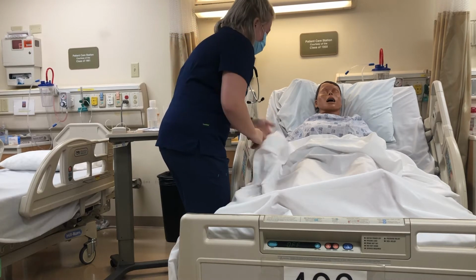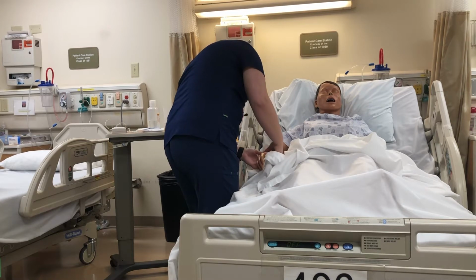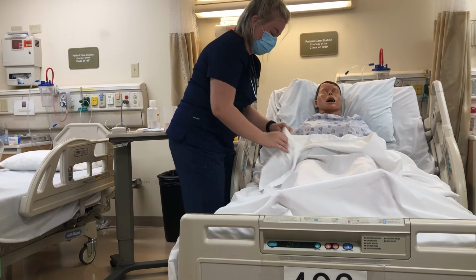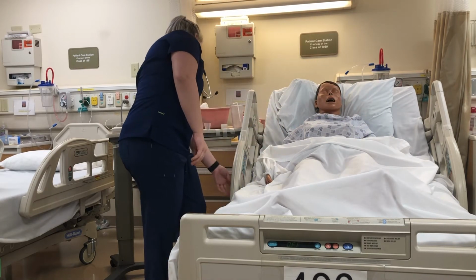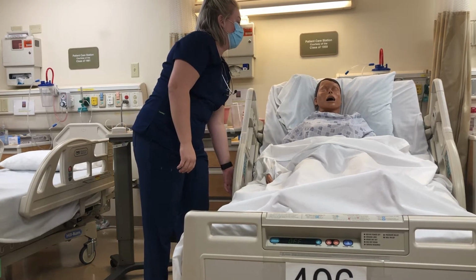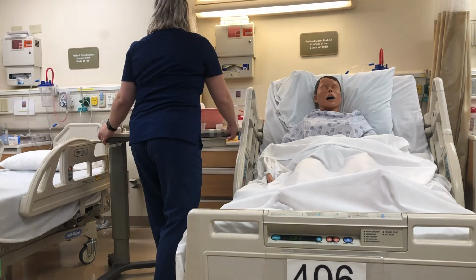So the first thing I'm going to do is just confirm your name and date of birth. Scarlett Smith, 2/13/1977. Okay, great. Alrighty, Miss Scarlett, I'm going to sit you up just a little bit higher. There we go. Okay. Alright.